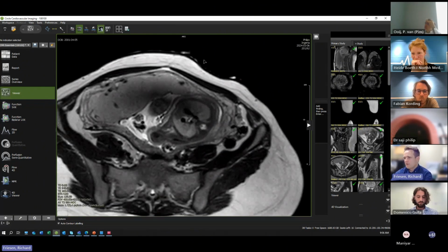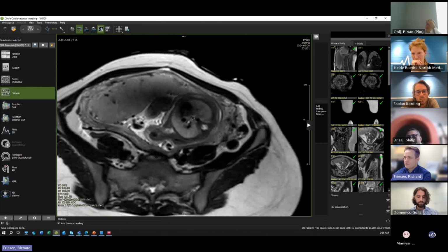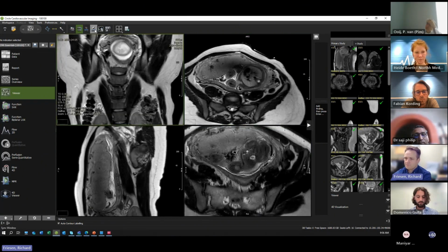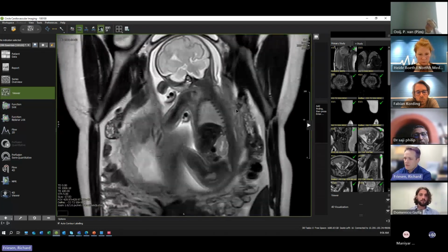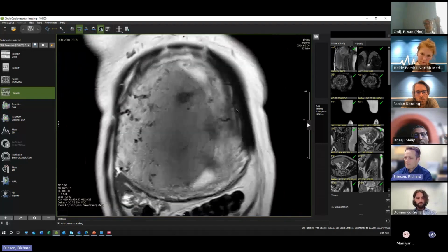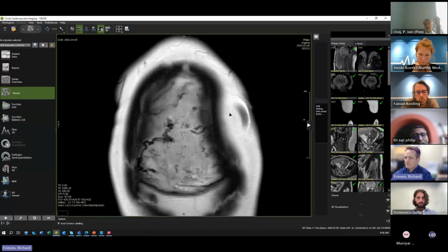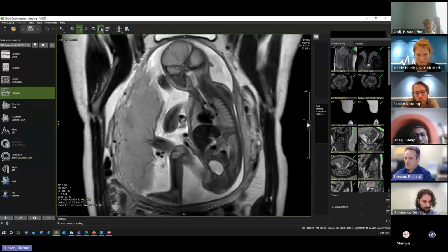And we'll get to a little bit more baby focused ones in a second, but this also gives us a nice look at where our Doppler location is. We felt good with this location. We had good Doppler signal there, and you can see its relation to the baby's heart. Again, looking at the maternal coronal view, as you come out, you can also see the maternal belly button and where the Doppler is in relation to that. So that helps us when we go in the scanner to have a little bit more of a reference point of where we might want to adjust the Doppler if needed.